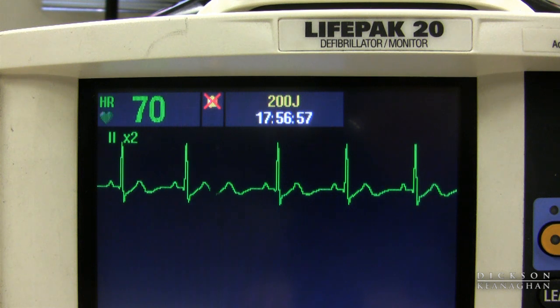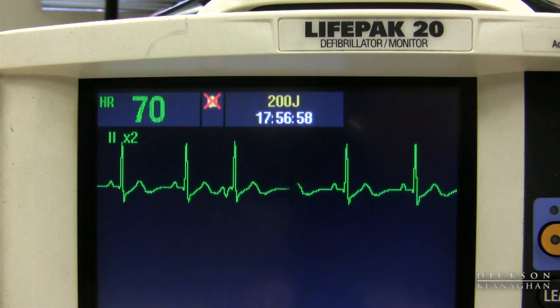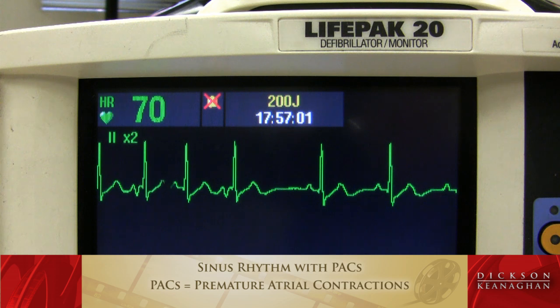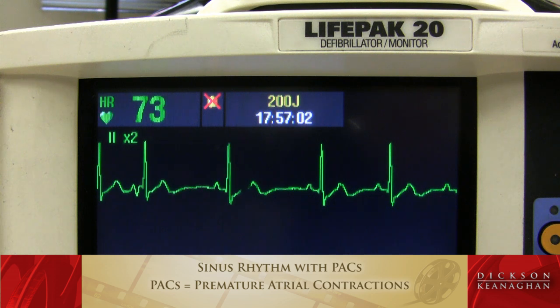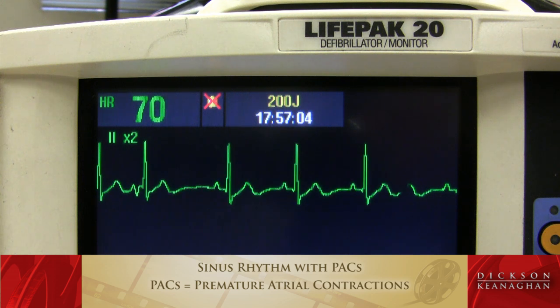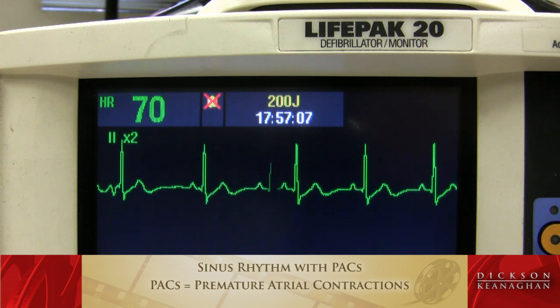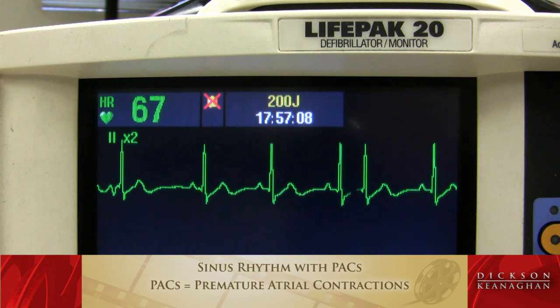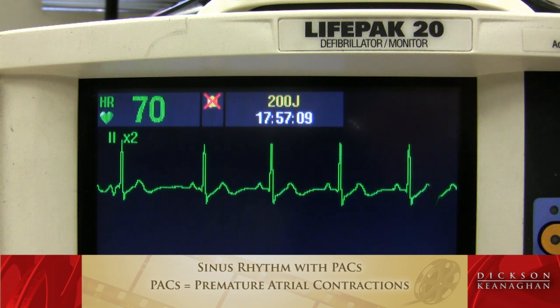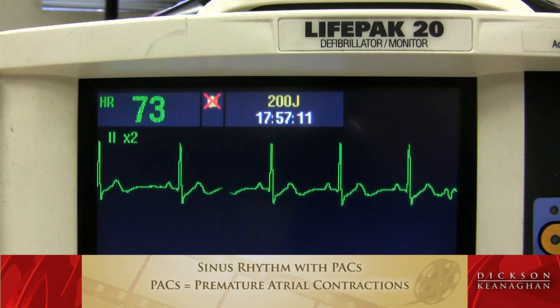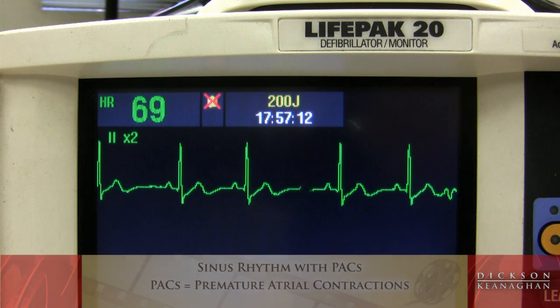Here is sinus rhythm with PACs. It's an ectopic firing in the atrium that causes an irregular rhythm to occur, but usually no symptoms. PACs.